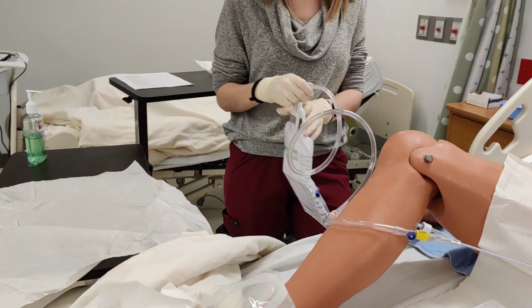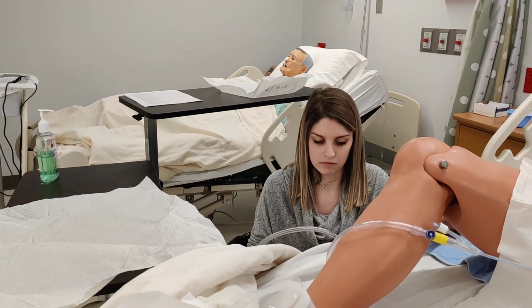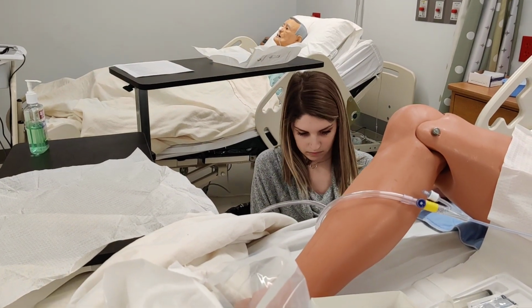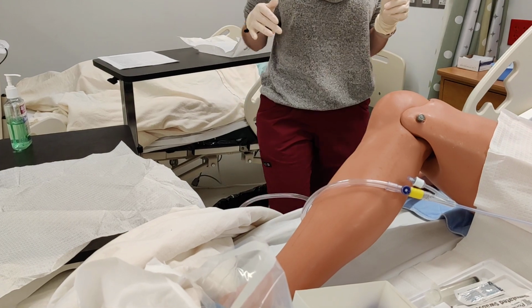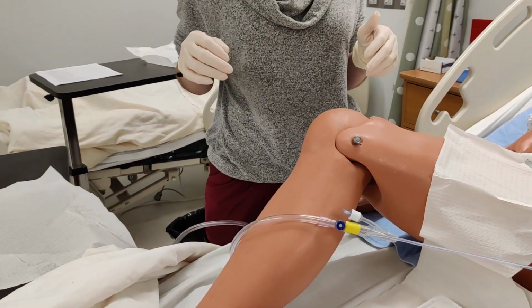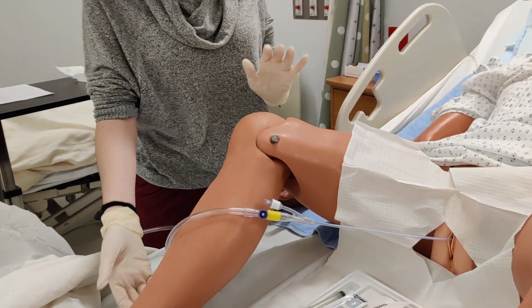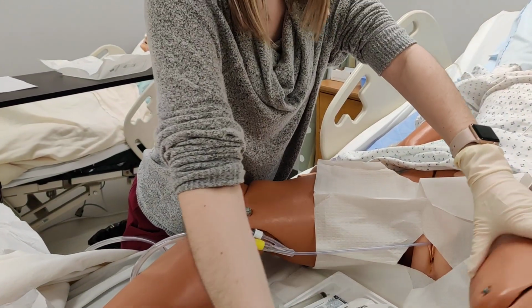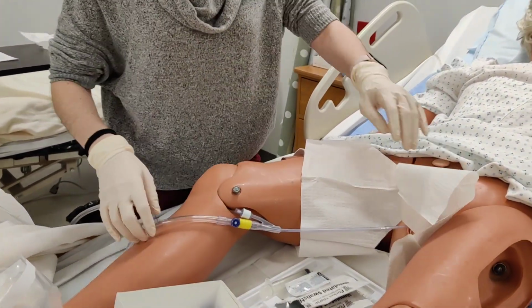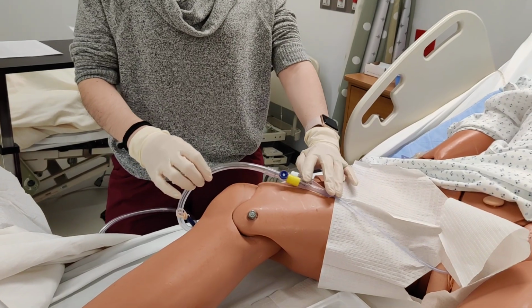And she's going to hang it on a non-movable part of the bed below the level of the bladder. All right. And then once that's hung, we would get our patient positioned so that the legs are down. Make sure that nothing is pulling on the Foley bag itself or the catheter itself, and we're going to attach it to the inner thigh.